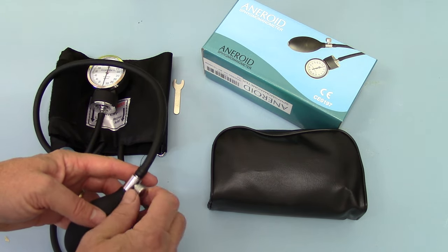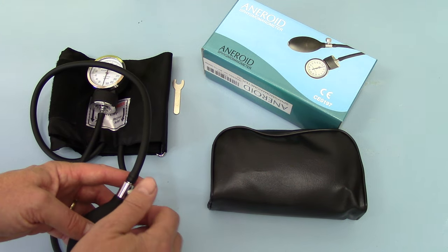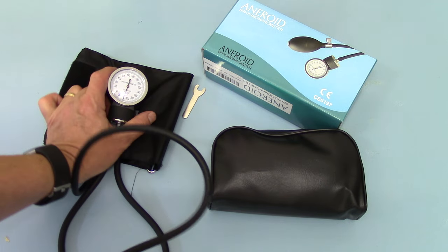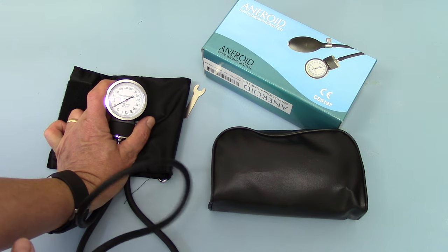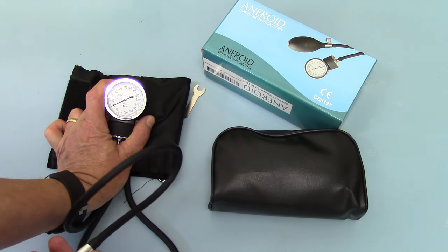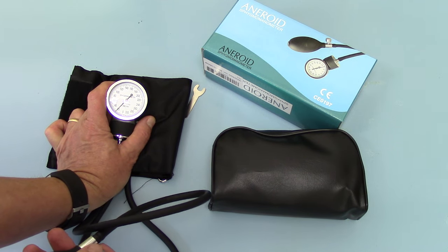For inflation, this is the release valve — it closes in a clockwise direction and is released anti-clockwise. So if you close the valve and apply pressure onto the cuff and pump, you will see the pressure starting to come up in the cuff. If you then release it, you'll see the pressure going down to zero.